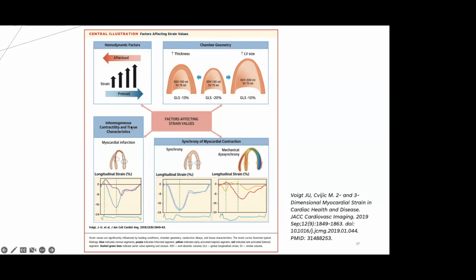If our myocardium is not contracting homogeneously, then that can also affect our strain. And then finally, if there's desynchrony, there's a conduction disease that can also impact our strain measurement. So important to keep these in mind when doing our analysis.